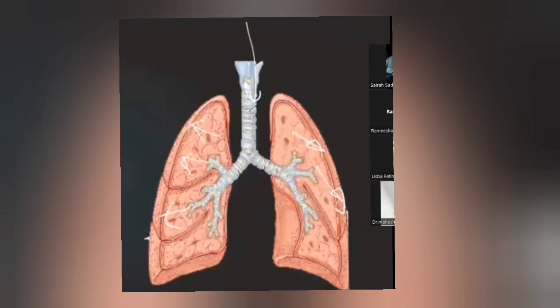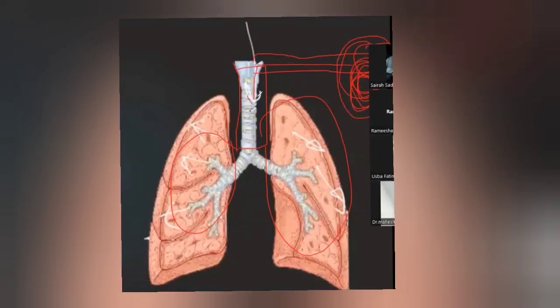As you can see, this is a very neat diagram of the whole airway system. This is the tube and this is the balloon. These are the balloons. Okay. Let's say this is my ventilator tubing circuit and this is my ventilator. It is blowing air inside. So there may lie a problem over here, there may lie a problem over in this part, or maybe in this part.